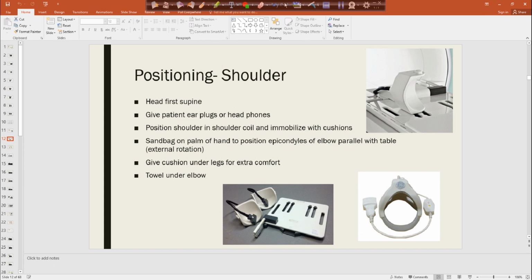That's a great tip. Because of our anatomy, it's hard to get into that coil, so sometimes they have to dip in and straighten up. Putting a sponge under the unaffected side allows them to slide into that coil a little bit better, and it's not as painful. Because if you're laying completely on the back, that coil really starts to push against the front. A lot of people complain because it's such a hard, stiff coil that causes a lot of pain. And a lot of pain is anterior, like a rotator cuff injury, where it's pushing right on that area that's already tender. So that's a good tip.